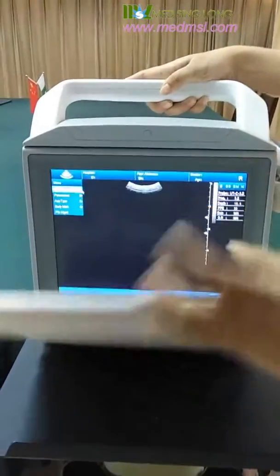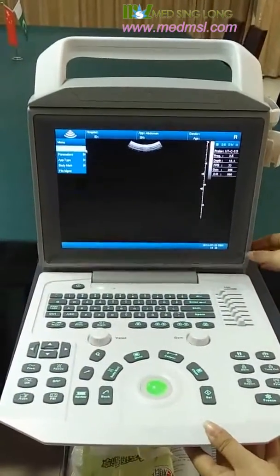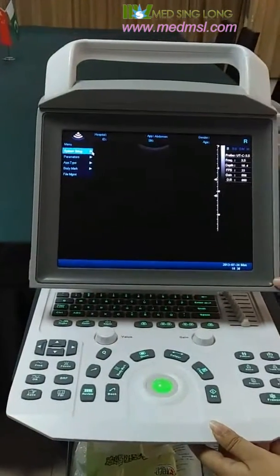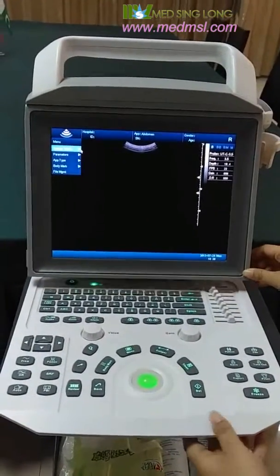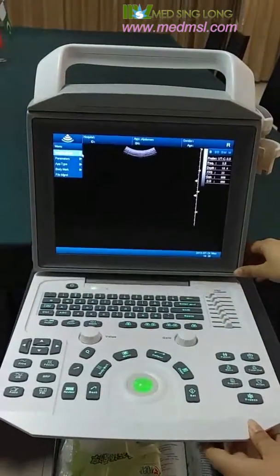We open it now. Here is a 12.1-inch LED screen. It is adjustable, with an angle range of 0 to 90 degrees.